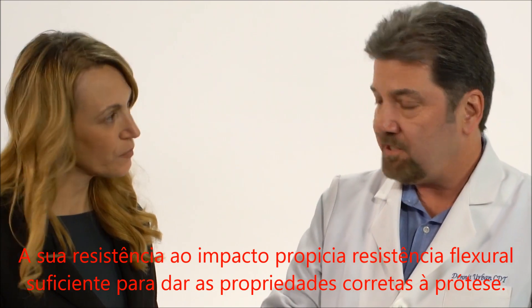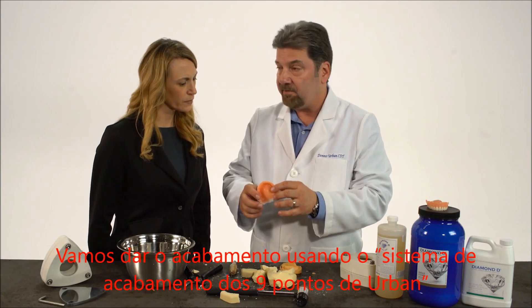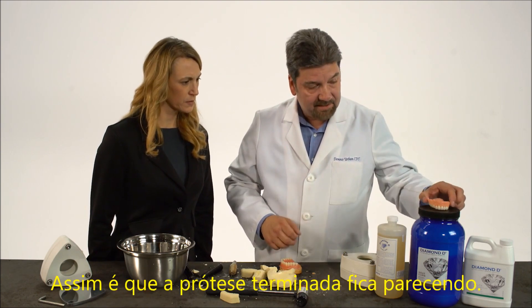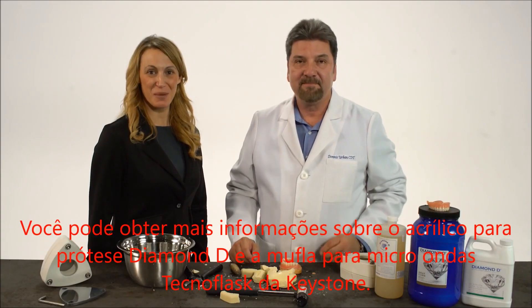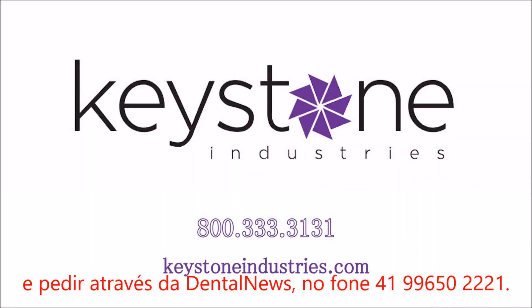It's impact resistance with just enough flexural strength to give you the right properties. Now we're ready to finish and polish our denture. We're going to finish it with the Urban Nine Point Finishing System and polish it with the Hatho Polishing Kit. This is how the finished denture looks. That looks great, Dennis. Thank you. You can get more information about Diamond D Denture Acrylic and Keystone's Microwave Technoflask and order it online at KeystoneIndustries.com or call us at 800-333-3131.